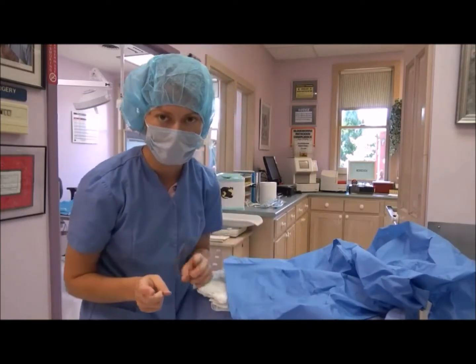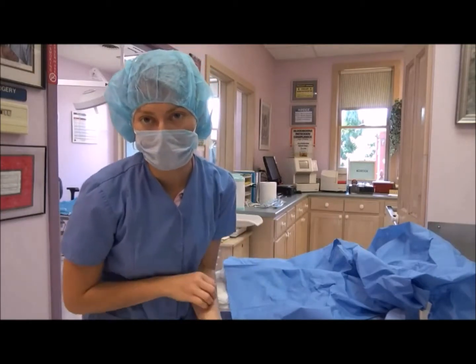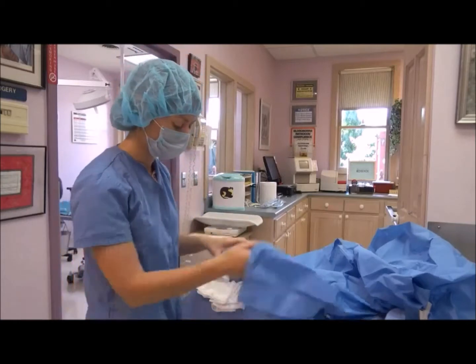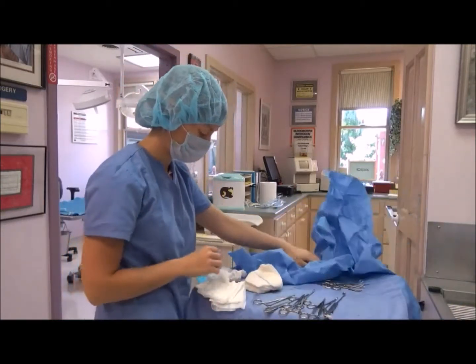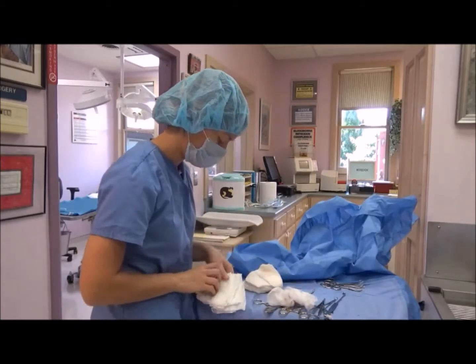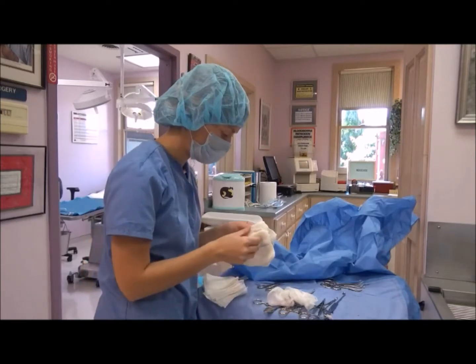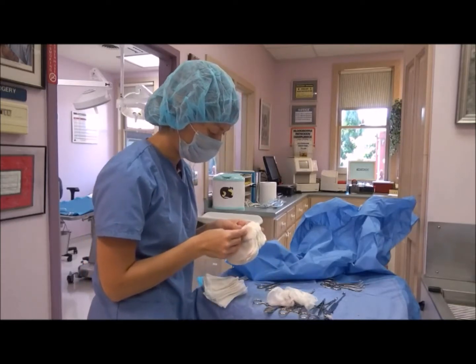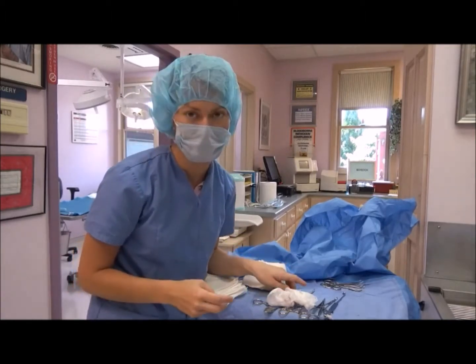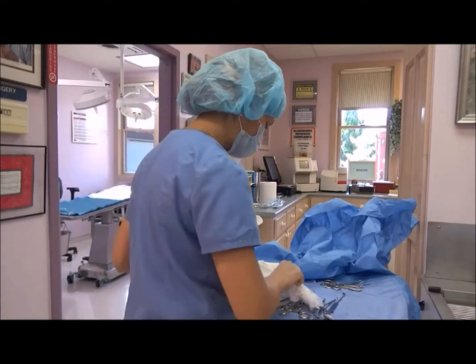So you also want to double check your sponge and tool count. This is kind of like a double check because you check them just prior to the doctor making the closing sutures on the patient. So our sponges, we started with 20, so we have 1, 2, 3, 4, 5, 6. Okay, so I have 18 here, which makes sense because I just threw 2 away in our medical waste bag, so we're good here.